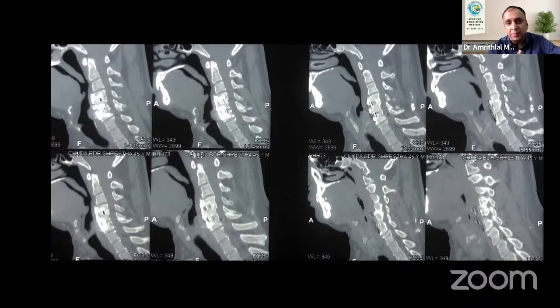Yeah, so nice restoration of the lordosis at that level, but I'm a little concerned about the C3-4 level for the future. But yeah, 4 years is a good time, it stabilized. Hopefully some osteophytes form there and it will naturally stabilize. I was looking at C6-7 also. I felt that level was quite stenotic. So I would be looking at even those levels.